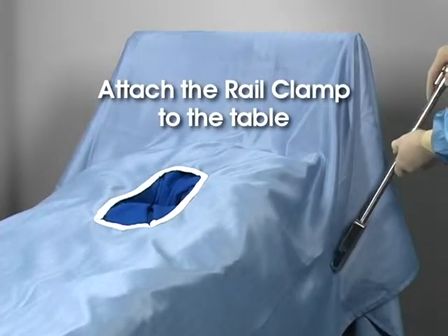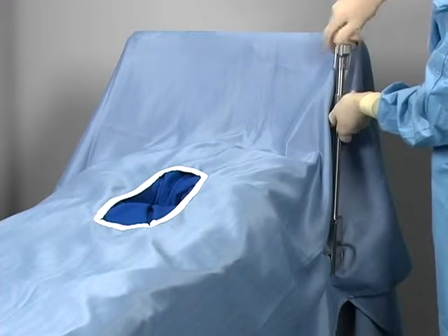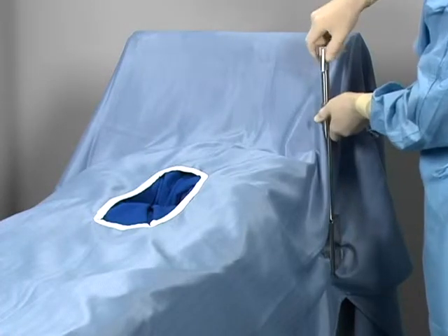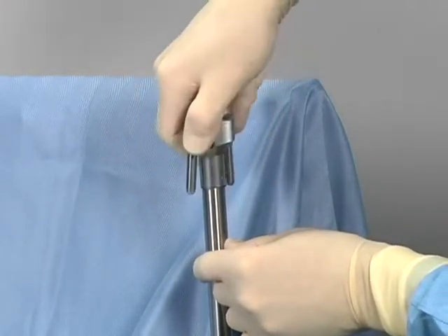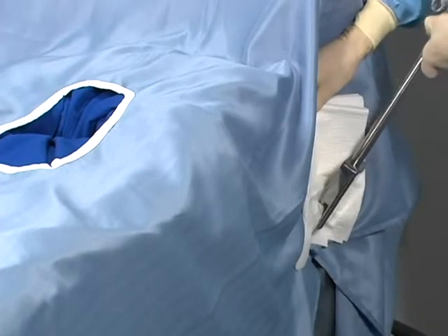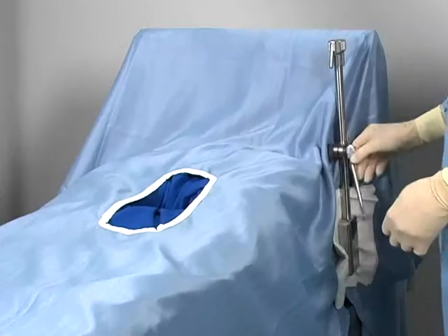Attach the Elite 2 rail clamp to the table. The Elite 2 rail clamp is secured to the table rail over the sterile drape on either side of the table without having to break the sterile field. Offset the clamp to ensure maximum accessibility to the operative field. To attach the clamp, the lower jaw is hooked under the table's rail and the top of the rail clamp is turned clockwise to secure it. Use the dog ears to give additional purchase. If using non-disposable drapes, mount the clamp over a sterile towel to protect the drapes.